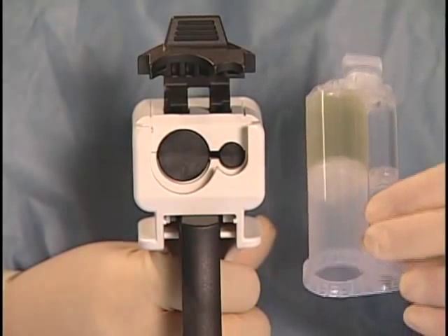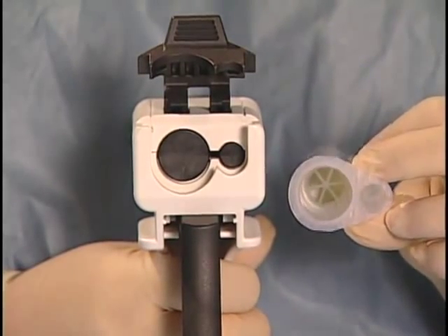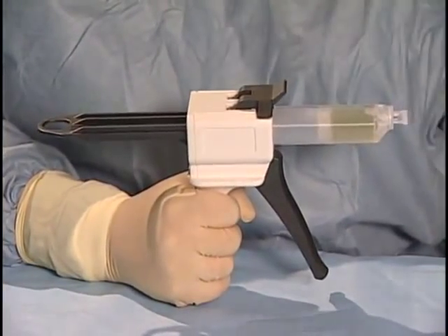Next, align the small and large barrels of the solutions cartridge above the corresponding small and large plunger heads. Slide the solutions cartridge down into position and push the cartridge retainer latch down to lock.